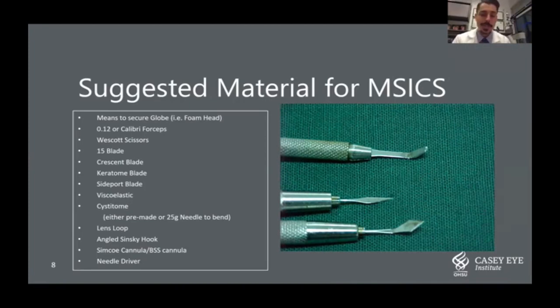And for us, we would obtain the instruments from a supplier in India. So we could buy all of the instruments that we needed for the wet lab for under $100 for the kit. So with just a little bit of funding, you could have several instrument sets that you could dedicate to the wet lab.